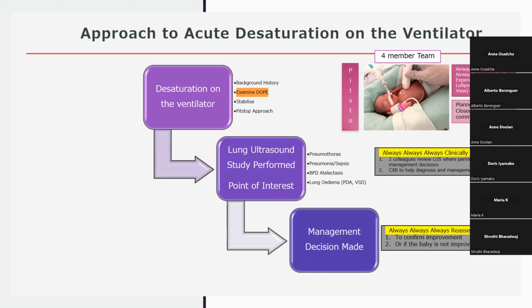We simulate for this, and in our face-to-face course that we're running next in June, we talk participants through and get them to actually focus on how they're going to organize themselves and the ultrasound machine, to produce the best images with the ability to not compromise resuscitation. That often means compressions from the top end.